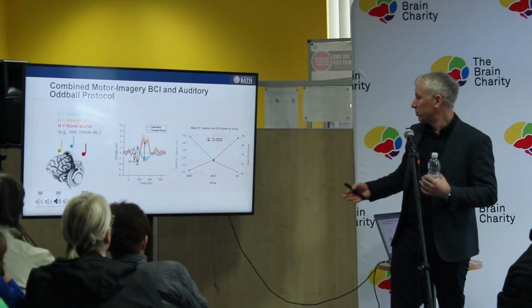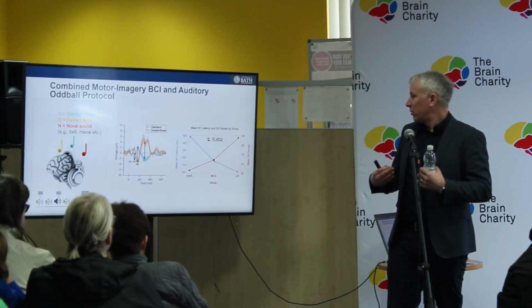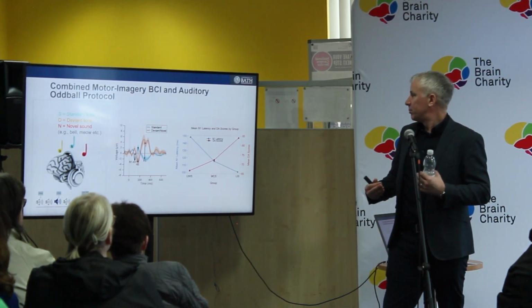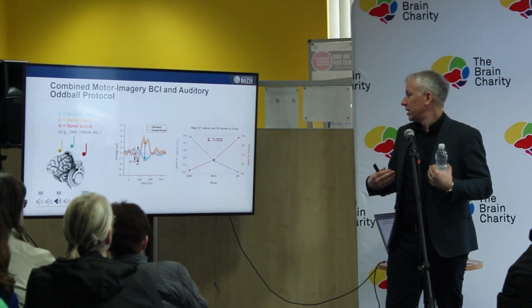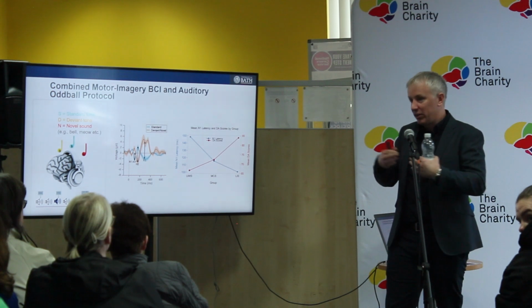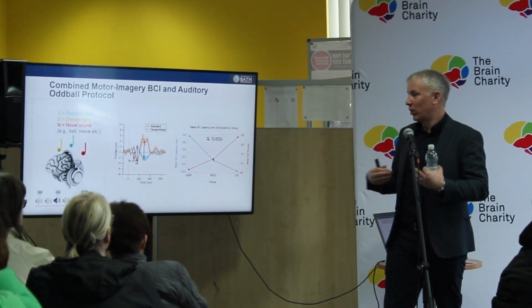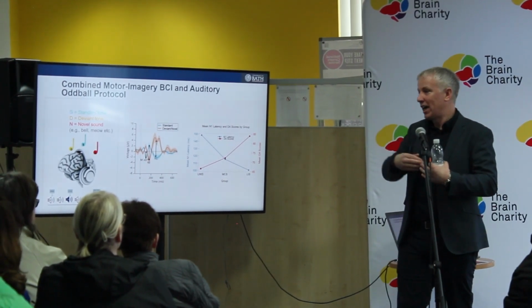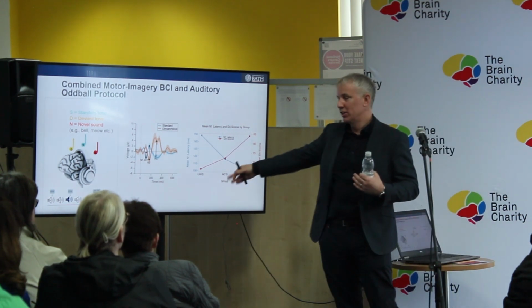What we've shown is that, based on the level of injury or diagnosis, people with UWS, which is the worst situation for anybody, have a longer latency in their evoked responses from the auditory stimulus, and they also have lower accuracy. Then as we go to MCS and LIS, accuracy increases and the latency comes down. So these are correlated in this way.